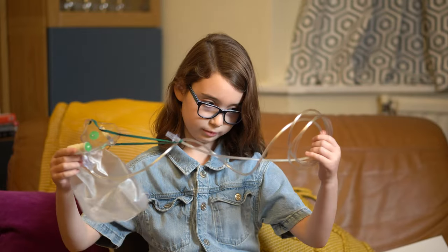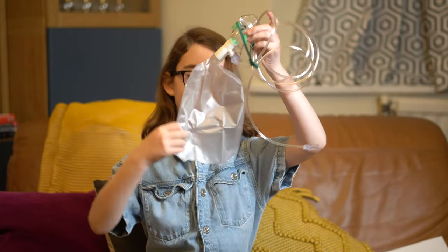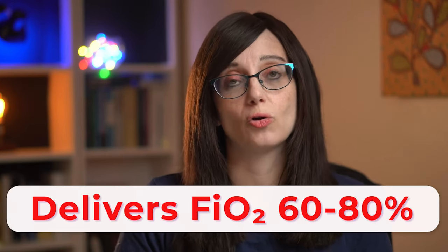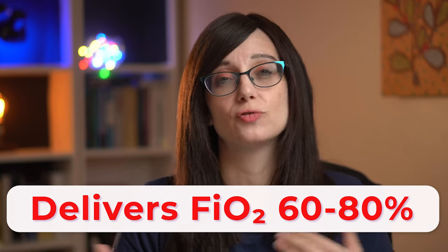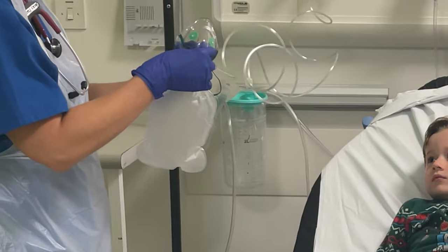A non-rebreather is a mask attached to a reservoir bag. The reservoir bag is filled with 100% oxygen, and there's a one-way valve so that CO2 can't go into that bag — it's just supplying oxygen and helps deliver an increased oxygen concentration to the patient. You can set it with a flow of up to 15 litres per minute on wall oxygen, and that will deliver an FiO2 of somewhere between 60 and 80%. It's really important that you make sure the bag remains fully inflated during the respiratory cycle.